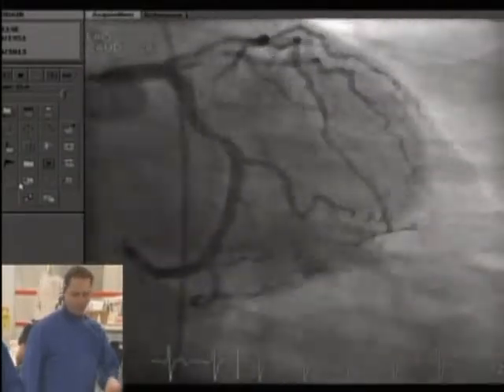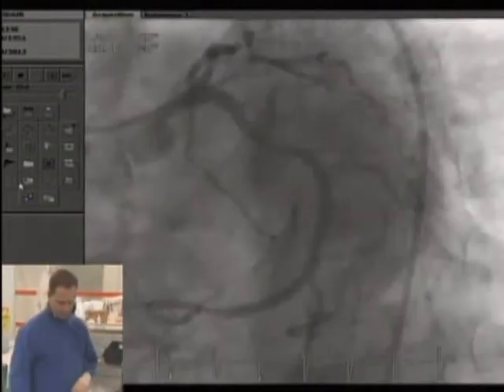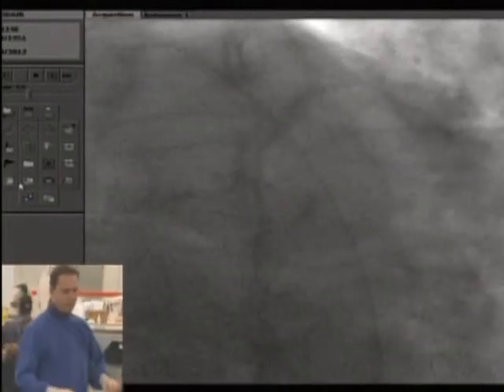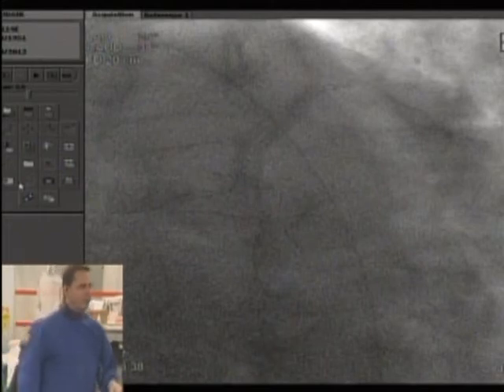Good. So welcome, Pedro. A couple of questions. Is this in-stent restenosis of a bare metal stent or DES? You said that this stent was implanted 12 years ago, is that right? That's right, 12 years ago, so that's a bare metal stent, Alex.